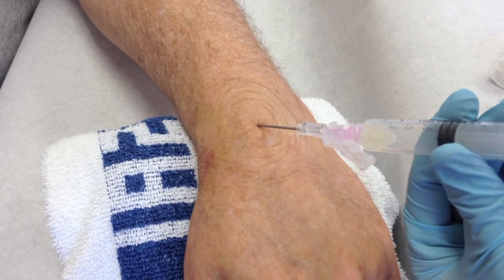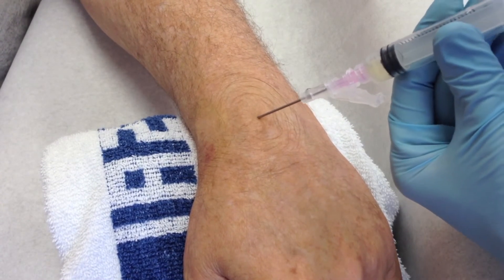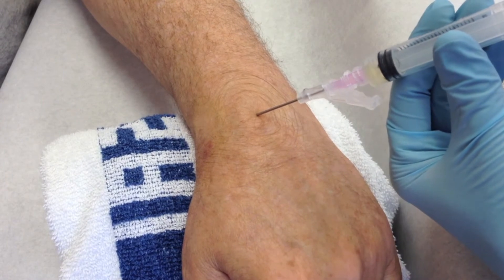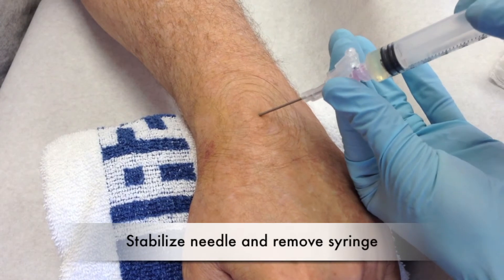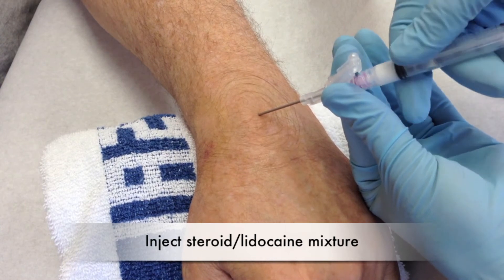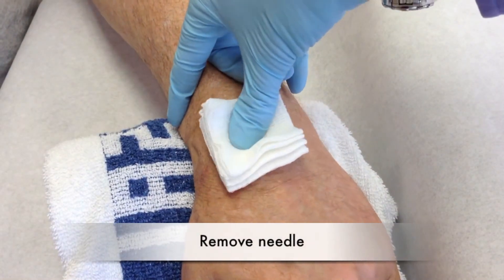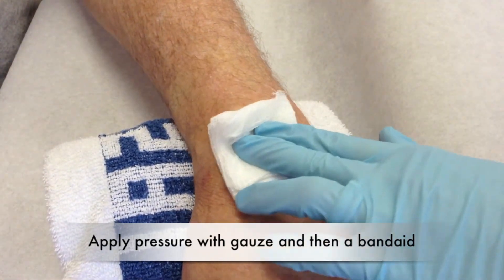Multiple puncture holes through the cyst wall are thought to help keep the cyst from recurring. After aspirating, stabilize the needle by holding the hub, twist off the syringe, and replace it with the pre-drawn steroid-lidocaine mixture. Make sure to shake the steroid in the syringe first so the precipitated steroid can be mixed back in. Then remove the needle and apply pressure with the gauze until the bleeding has stopped, and apply a band-aid.